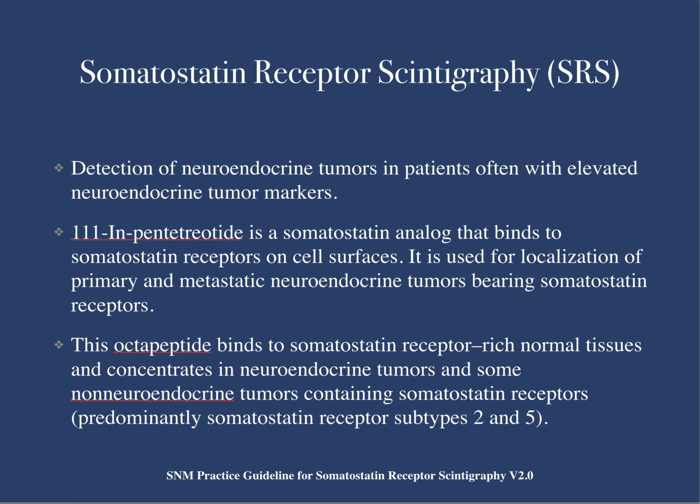All right, let's switch gears and go on to the fourth part of today's lecture, somatostatin receptor scintigraphy. And this relies on detection of somatostatin receptors on neuroendocrine tumors. And there's a variety of molecules that are targeting agents that have significantly improved over the last few years. The original molecule was octreotide, a targeting agent that was typically labeled with indium 111.